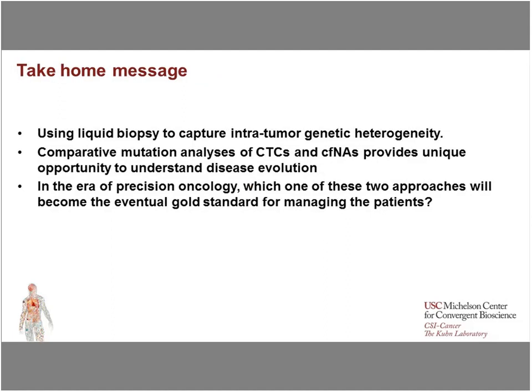Then we go to the very last slide of today's talk: liquid biopsy and the Oncomine assay. Using liquid biopsy to capture the intra-tumor genetic heterogeneity, and comparative mutation analysis on CTCs and analysis of cell-free nucleic acids, provides a unique opportunity to understand the disease evolution and the treatment response.